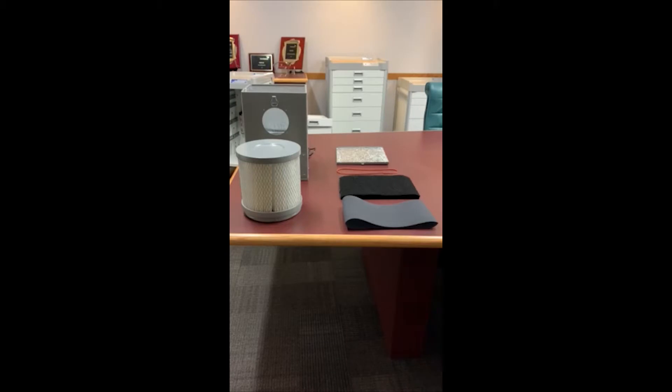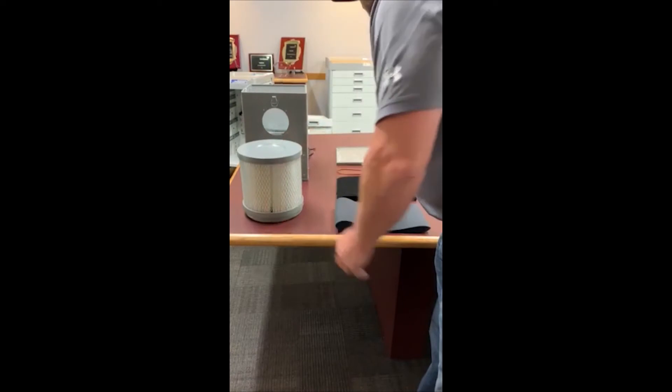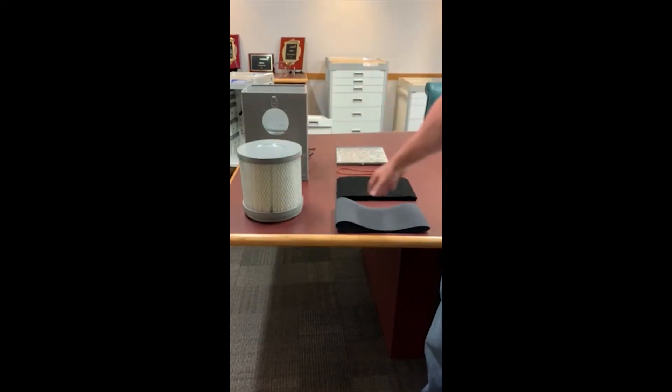We're going to go through how to install the filters in your main HEPA fan filter for your dry store cabinet. This here is the 40,000 MFF, the main fan filter. Here is the external filter that goes around the outside of it, the internal filter that actually goes on the interior of it, your O-ring, and then the actual housing for the fan itself.